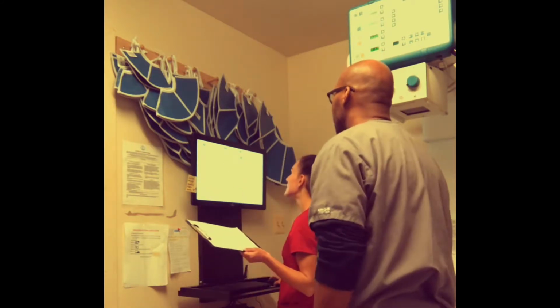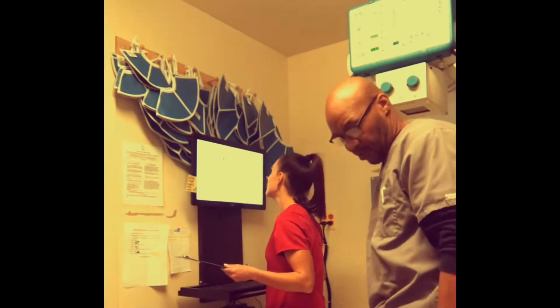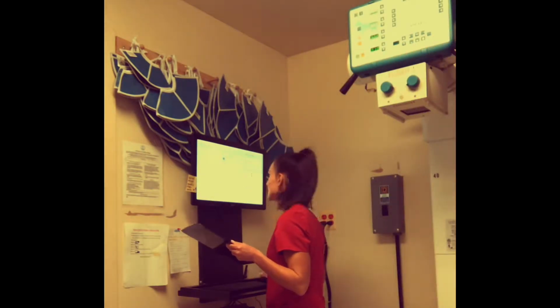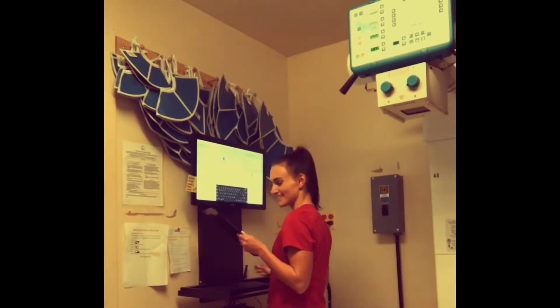Lulu Logston is one of our many patients here at Boston Animal Hospital. She presented with abdominal pain and discomfort and vomiting. As a result, the doctor ordered abdominal radiographs.